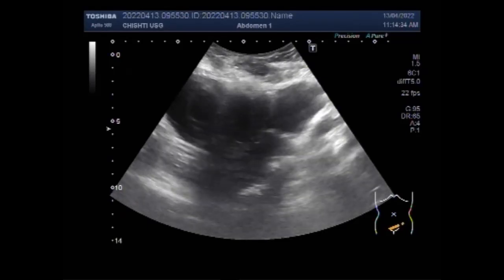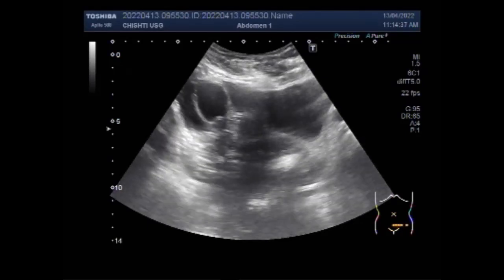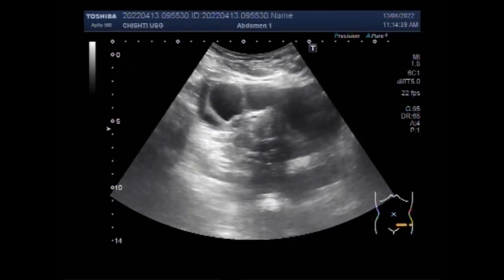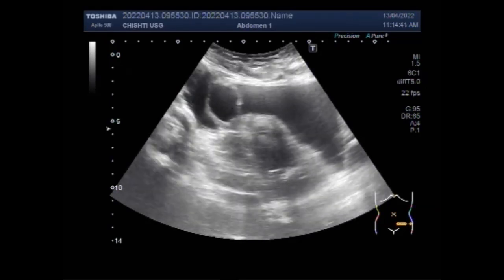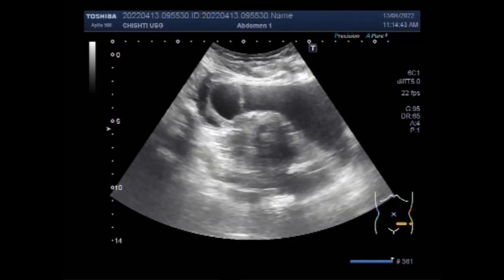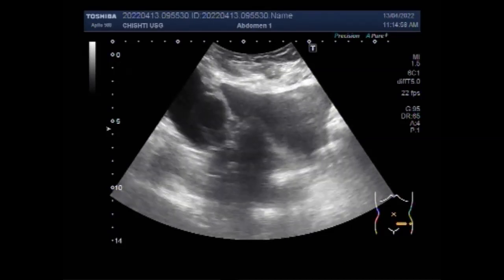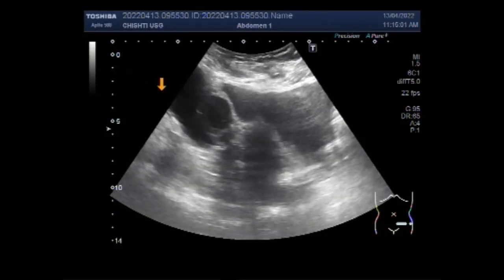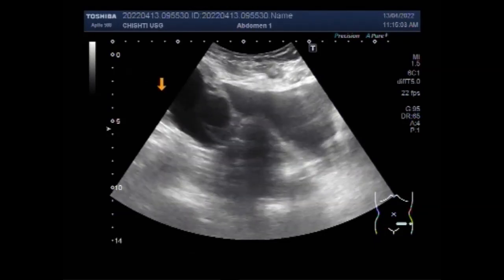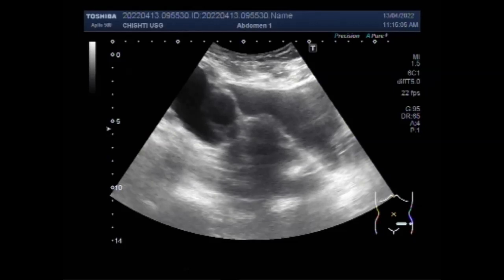Now you will see both ovaries. The left ovary in this case shows an ovarian cyst, and a daughter cyst is seen inside this larger simple cyst. This is the left ovarian cyst. This is the urinary bladder, and this is the uterus.